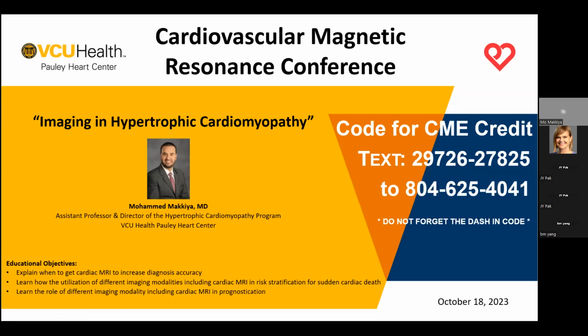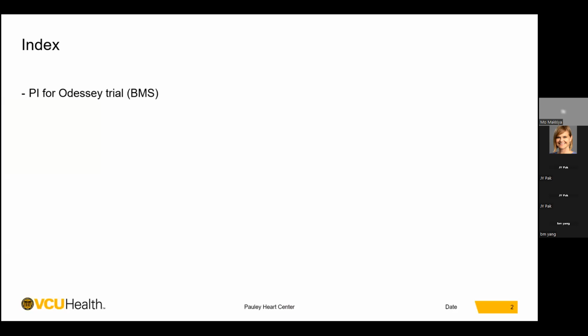Today's session, we're going to talk about imaging in hypertrophic cardiomyopathy. My name is Mohammed Makkiya. I'm one of the non-invasive cardiologists and cardiac imagers at VCU. And I'm the director, and I run the Hypertrophic Cardiomyopathy program here at VCU. Want to welcome you here, and we're going to talk about imaging in hypertrophic cardiomyopathy.